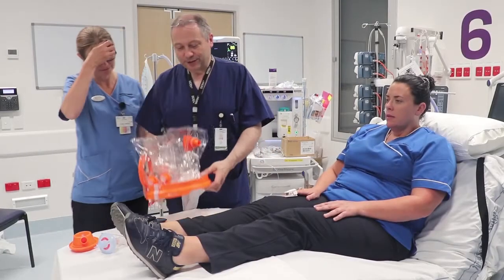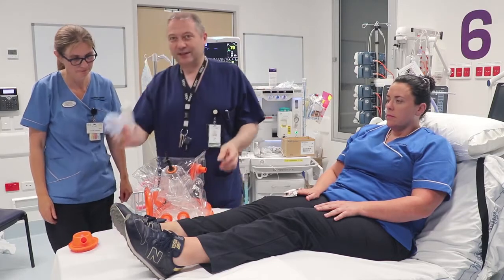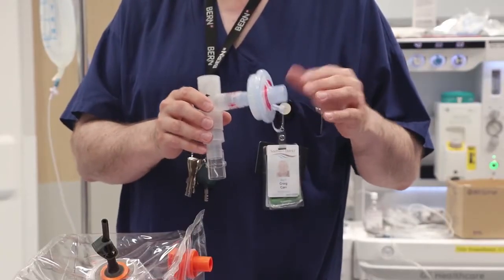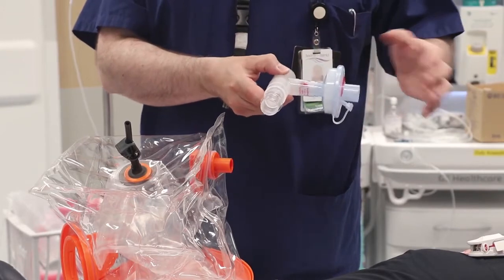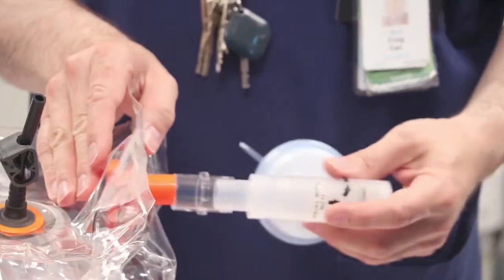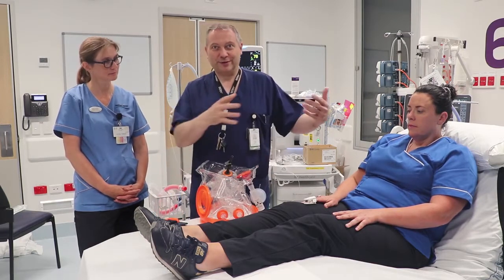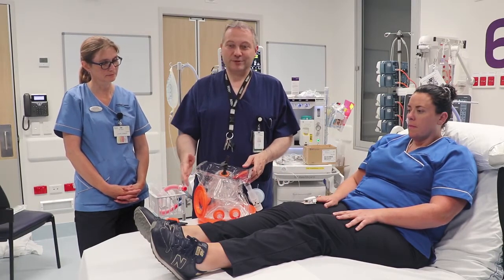Next we're going to apply the helmet and quickly review the different components. We'll place a CPAP valve, and assuming this patient has an infectious illness, we'll have an antiviral filter on the outflow of the CPAP valve. It's very important that the direction of flow from the helmet through the CPAP valve is correct — this valve is marked 'flow from patient', so this end goes onto the helmet. Prior to putting the helmet on, we remove the free breathe valve, which makes application easier and safer for the patient to breathe until gas flow is connected.